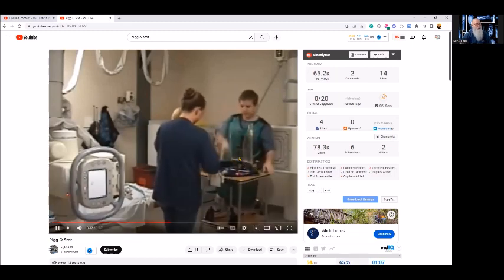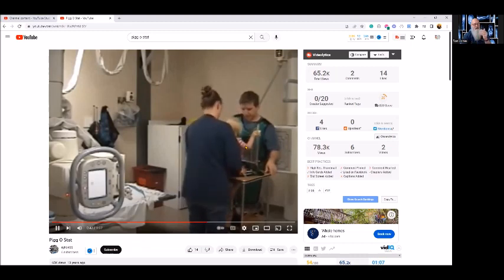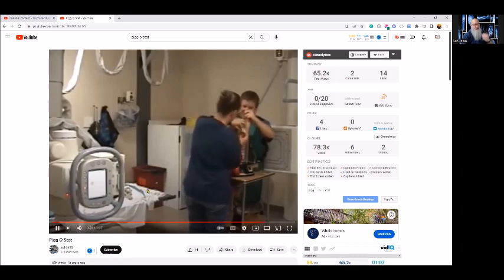And there's a holder on the backside of the Pigg-O-Stat that's going to hold the cassette. So you're not capturing the image in the detector, although you can. So if you don't have a parent, you just stick the kid in here, hold their arms up yourself, snap the thing shut, push them up against this bucky right here, go take the picture real quick. Now, there's no chance of them falling out or anything because they're locked into this thing. But you can take an image in the bucky, or you can have a parent right there. See how he's holding the hands upright?